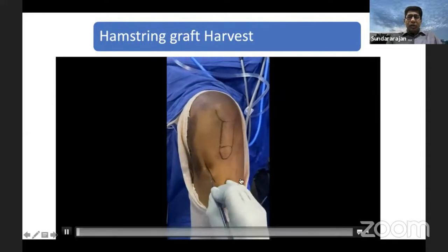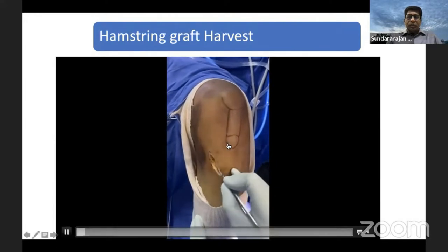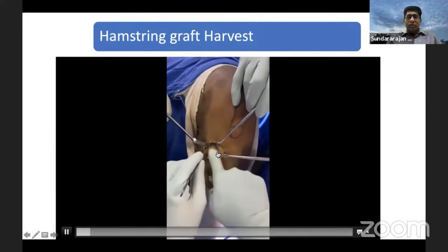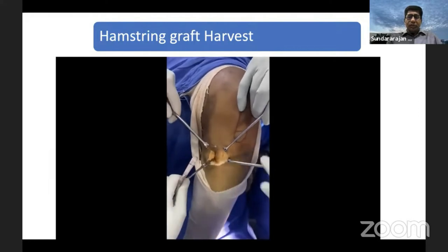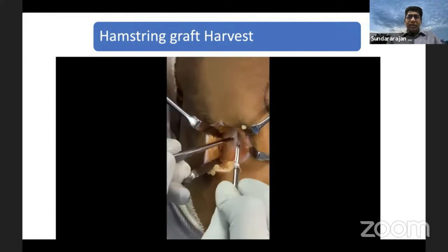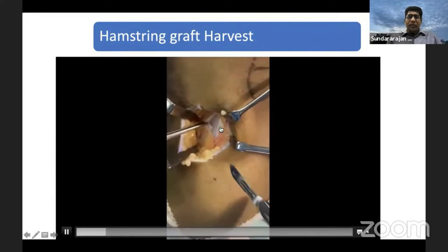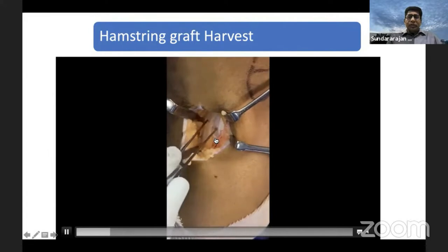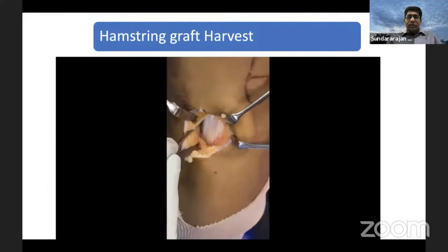You start with an oblique incision to avoid or minimize nerve injury. That is the tibial tuberosity — at least one and a half centimeters medial and distal to the tibial tuberosity is where the incision starts and ends. You can make a two to three centimeter incision, or if you are in a starting stage, you can even make a four centimeter incision. That is the Pes Anserina. I'm going to incise the Pes Anserina along the tibial tuberosity, almost on the shin of the tibia. You can see the Pes Anserina can be easily elevated just by making it with a size 10 knife.